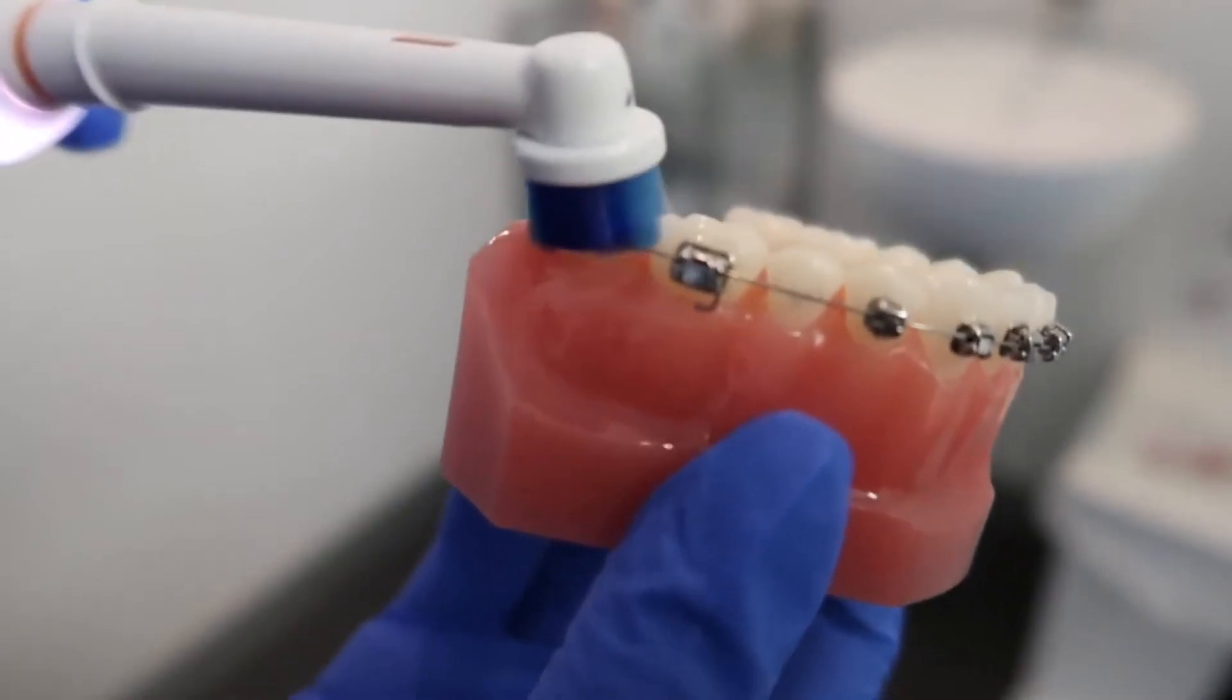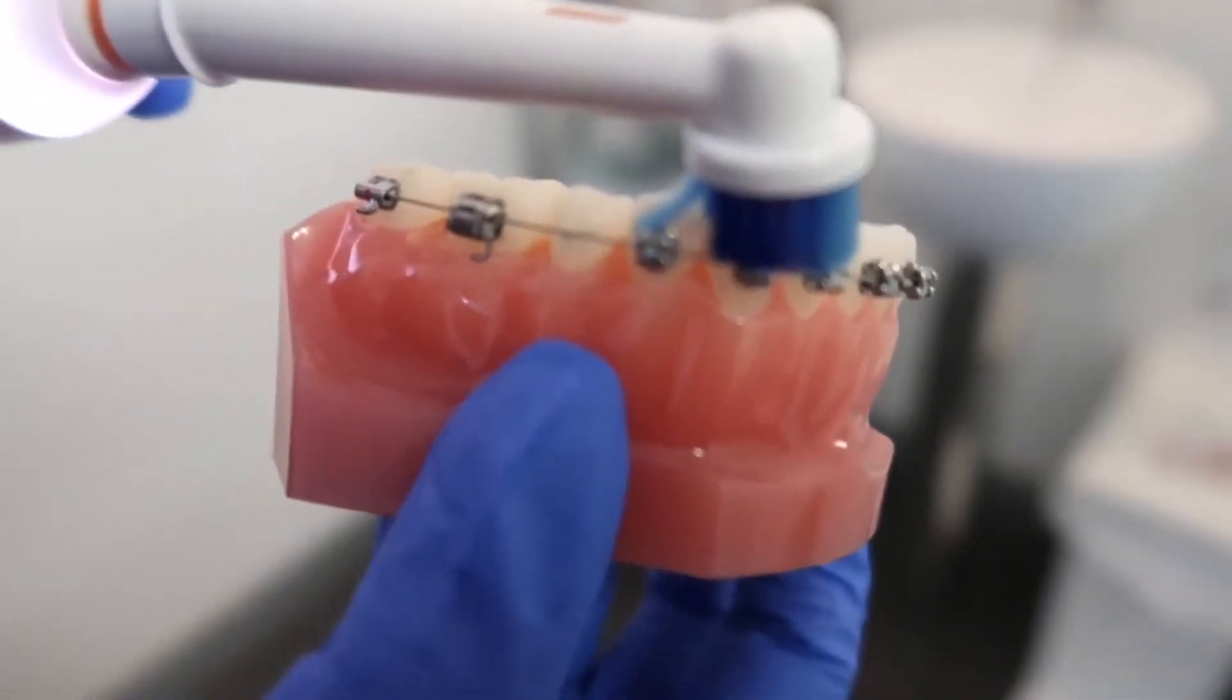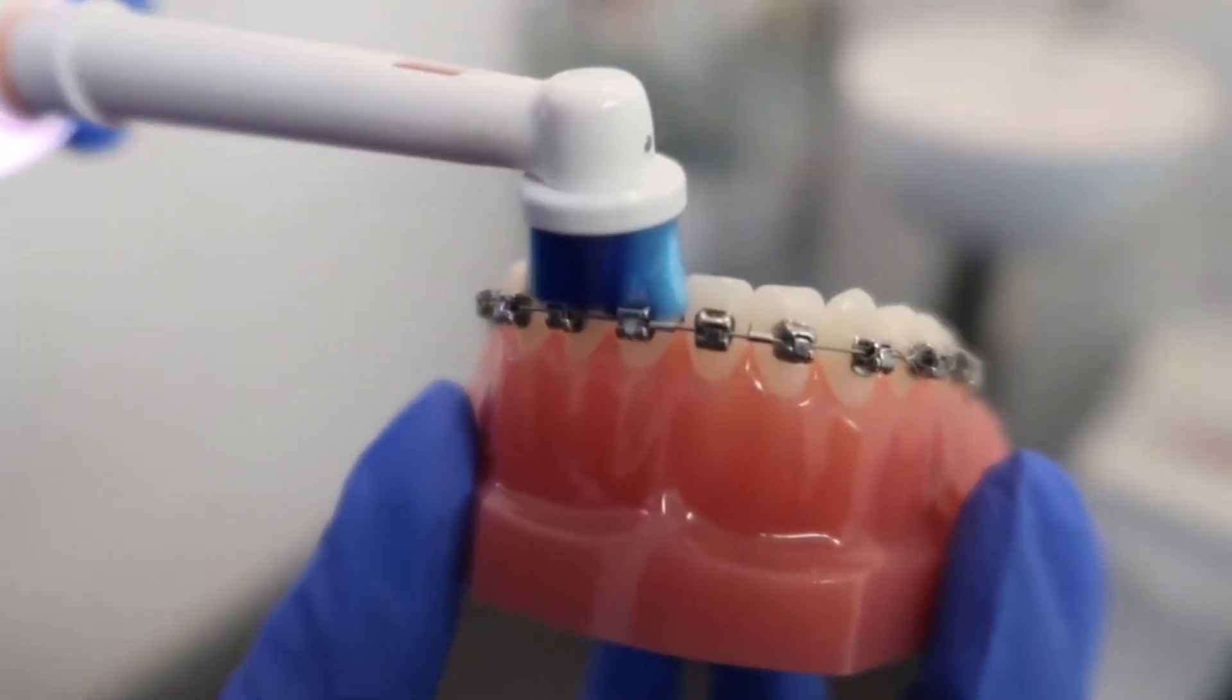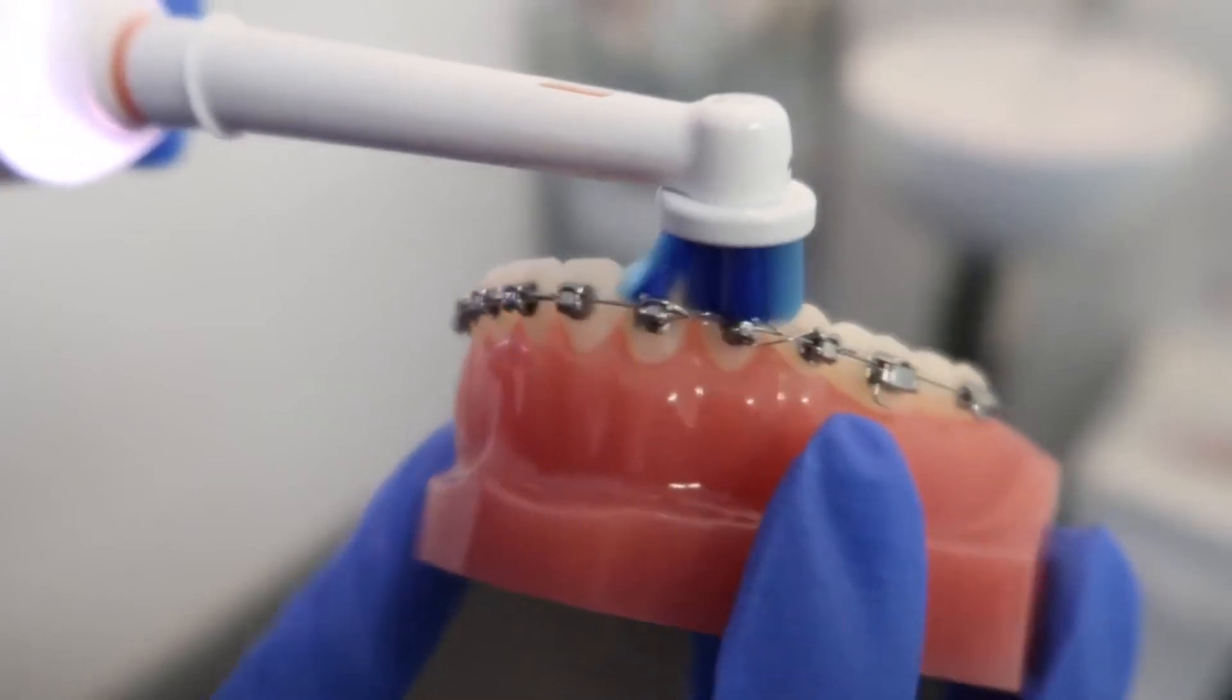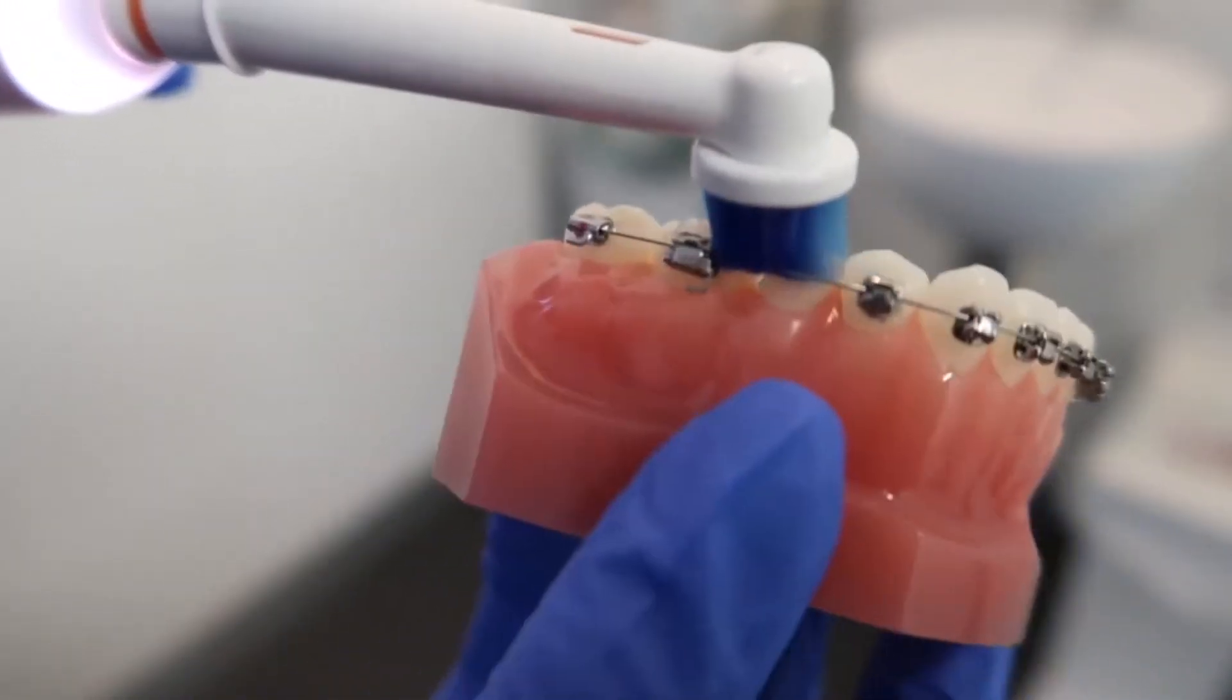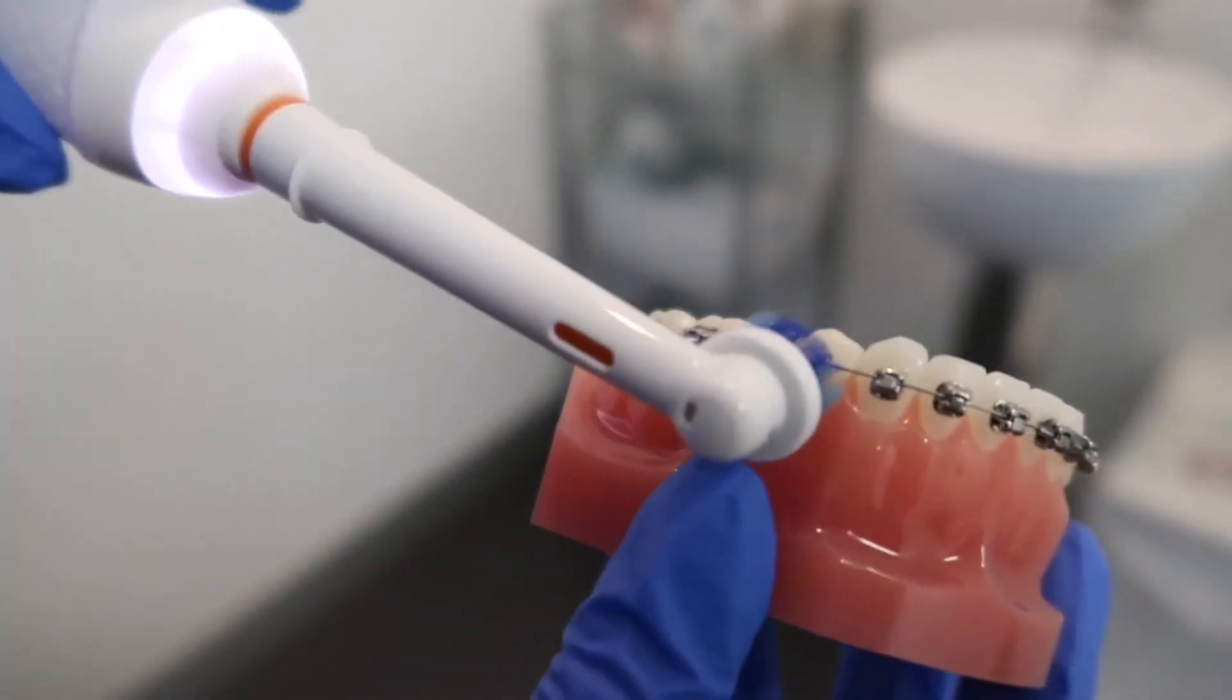Once you've done this, move on to cleaning the brackets of your braces. Brush on the tops first, and then follow this with brushing the underside of the brackets.